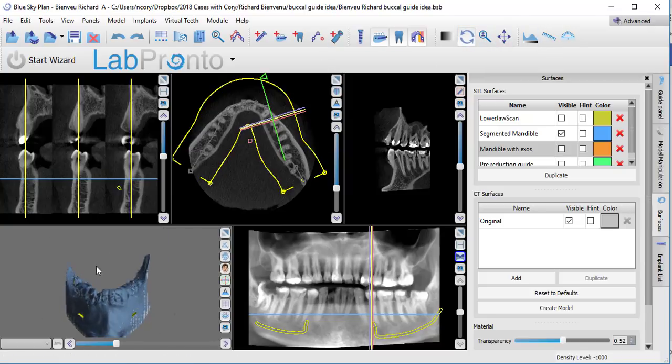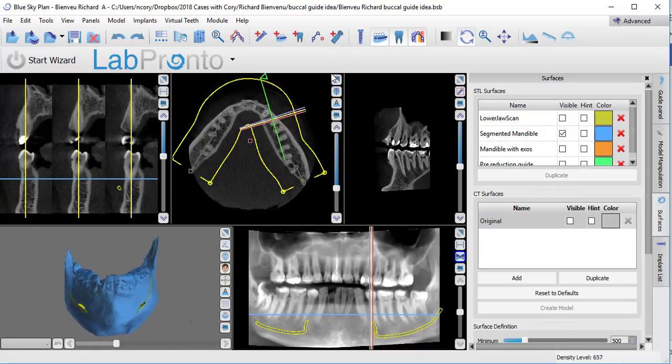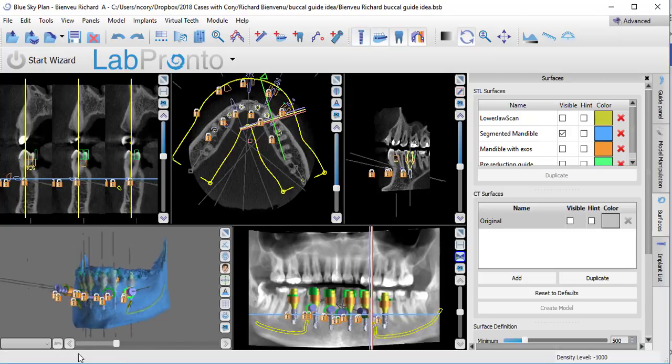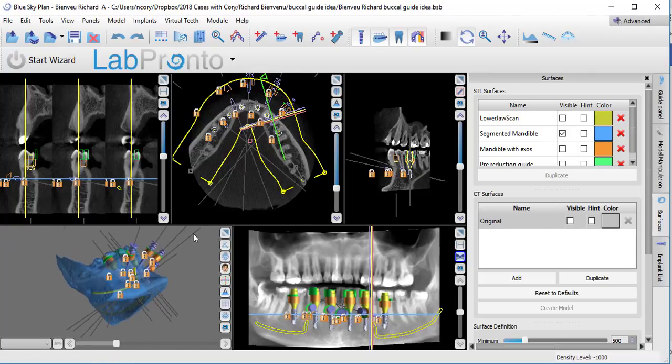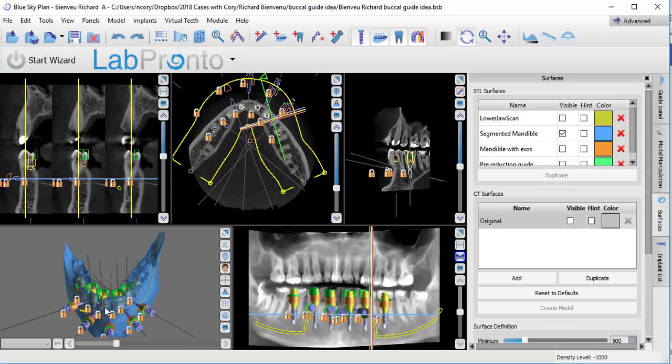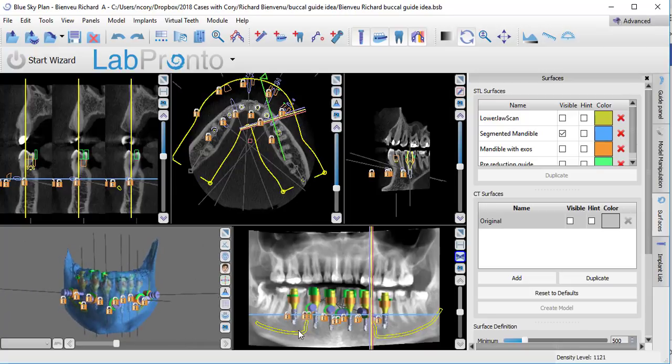So we've got our bone segmented. At this point, I'm going to turn off the CT view, and we can turn on our implants just to show you where everything is going to be. As you can see, there's going to be 5 pins. That's kind of overkill, but I just wanted to show the process. So we'll put a bunch of pins in there, and then we've got 6 implants that are going into the mandible. The first thing that will be required is bone reduction, and we're going to have to do that very precisely.